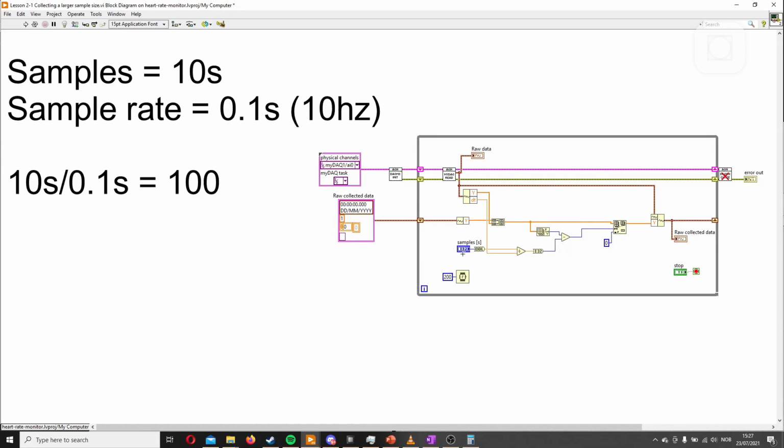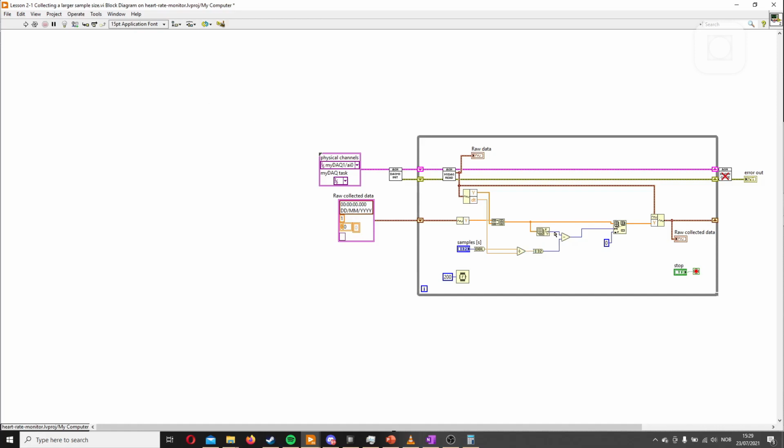Let's say we want 10 seconds of data. And for simplicity, let's say this thing samples 10 times a second. That means we want 100 samples of data. So it starts here, and then it divides 10 by 0.1, as this is not in hertz. And we convert this, and then this will become 100 here. And then it reads the total size of the waveform. Now let's say this one reads 150, we want 100. That means there's 50 too many here. So we will delete the 50 first in the array, because it reads from left to right of the array, leaving only 100.